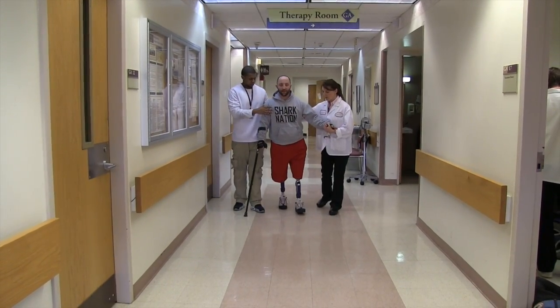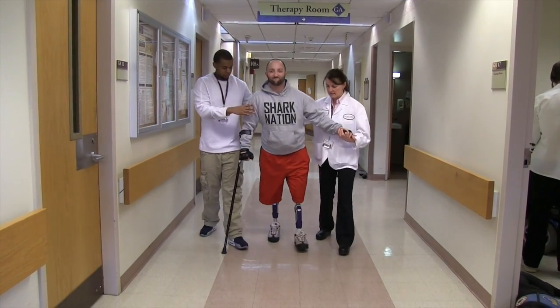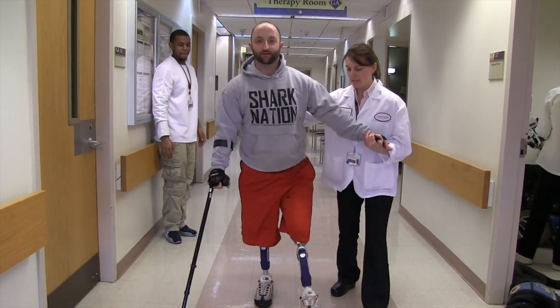On your arm. Legs going well. Then you step out a little bit, so he can see that he doesn't really need that much attention.